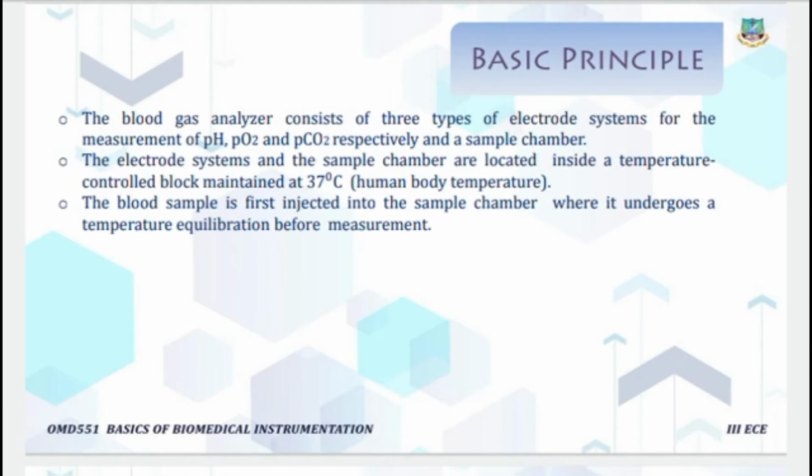The blood sample is first injected into the sample chamber, where it undergoes temperature equilibrium before the measurement by the blood gas analyzer.